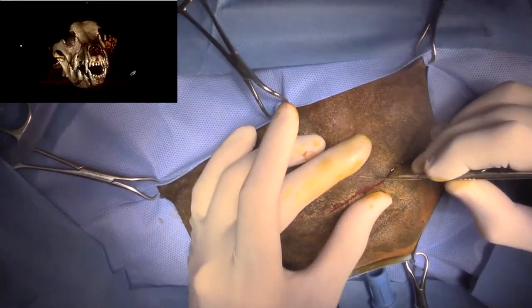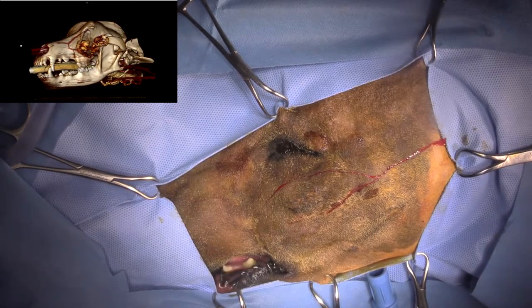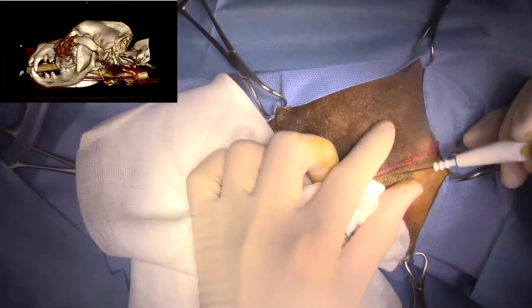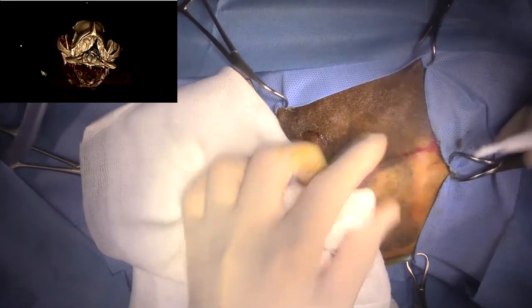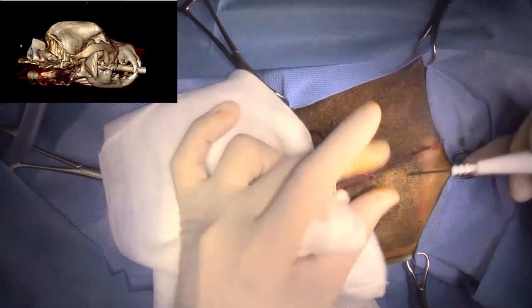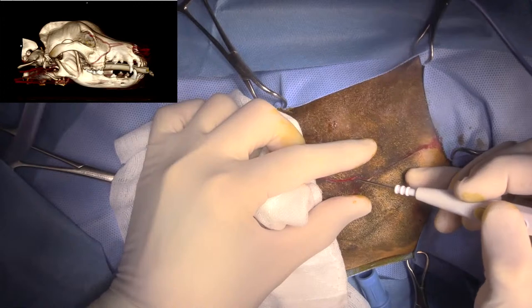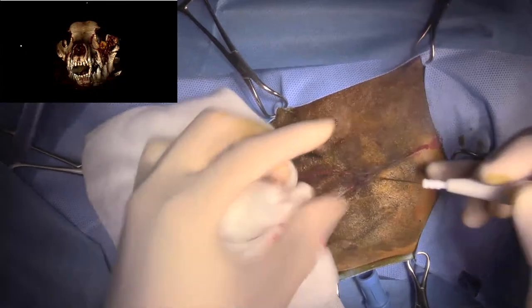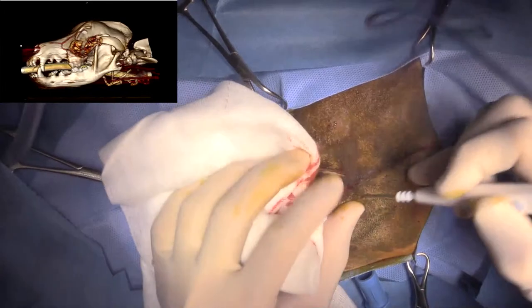And I know that somebody's going to ask me whether we're going to take the eye out, and the answer is we are not, generally, with these guys, although the zygomatic arch is responsible for protection of the eye to some degree. I routinely leave the eye in on these patients. Now, there's a chance that we'll damage the facial nerve. And I can see the dog blinking as I cauterize in that region. But damage to the facial nerve in that area should not cause any problem in a dog that's not brachycephalic.